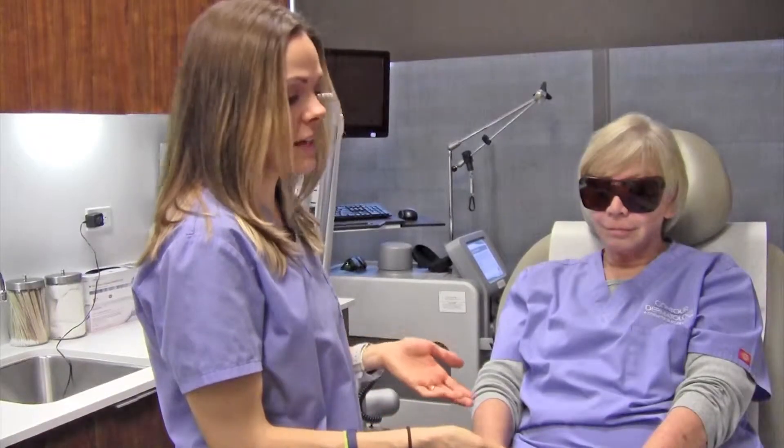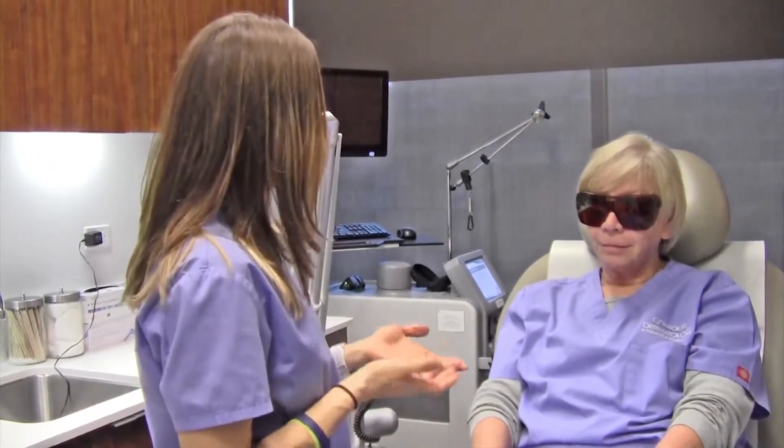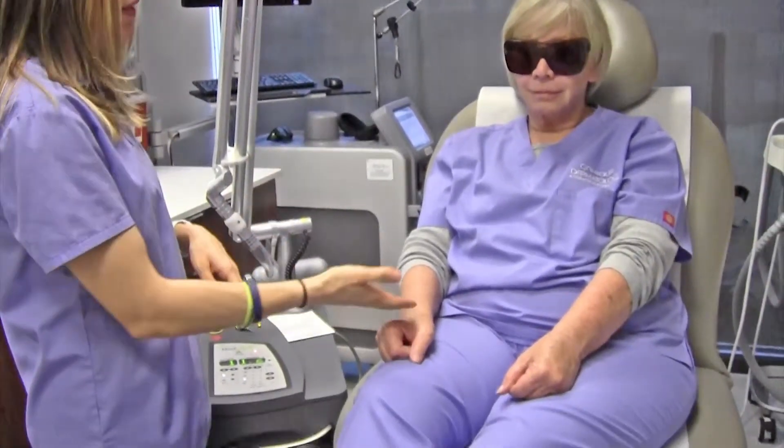So that's the end of the treatment. As you can see, it was very quick. She just had two small spots, but it was very fast. And how was the pain level? Nothing. So it's quick, easy, painless on the little lesions.